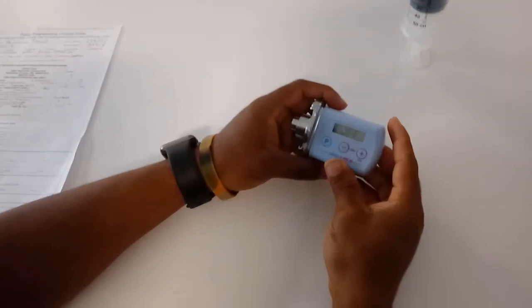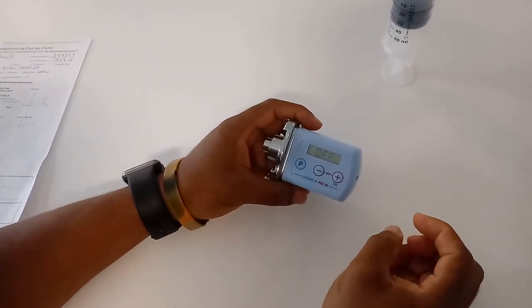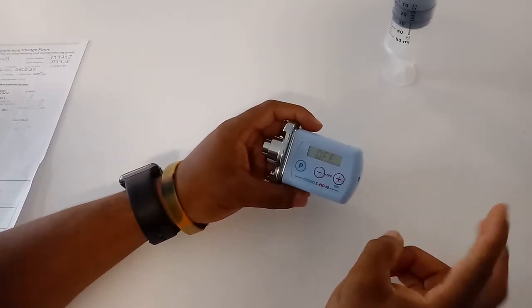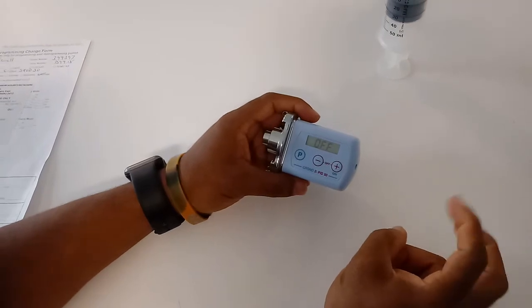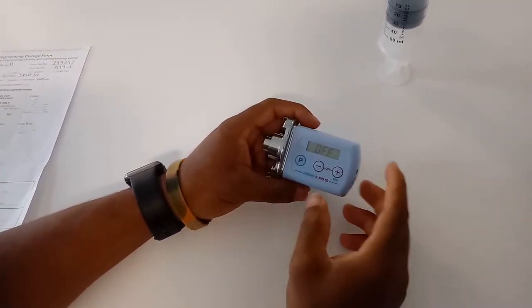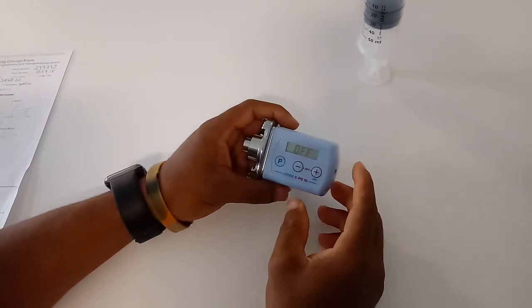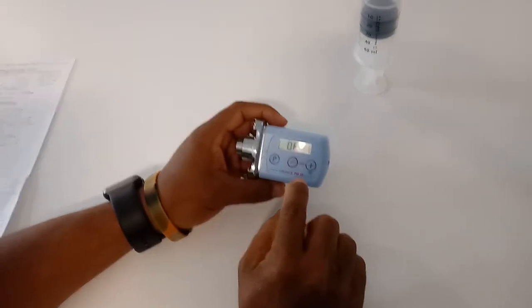Going to be programming this pump. In the time mode, only two things you're programming. You're programming your volume and you're programming your time. Now, notice I use the word volume first before I use time. The reason why I did that is because in this pump, when you want to program the volume, you program the volume when the pump is off. Okay, and we program the time when the pump is on.